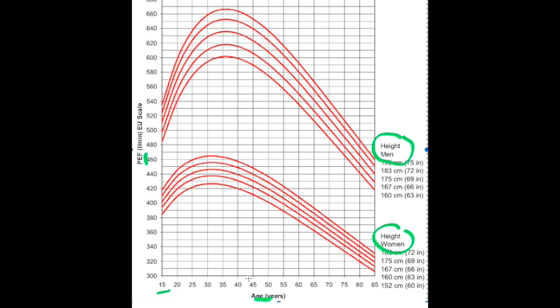With Nurse Mary, let's have a look at where she would be on this graph. We know that she's 42 years of age, which would be around this point. And we know her height is 153 centimeters. The bottom line here is 152. So if we went to this line, the normal for her would be around this point here, about there.